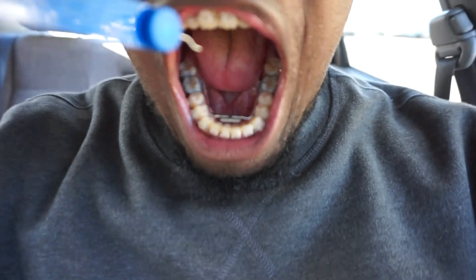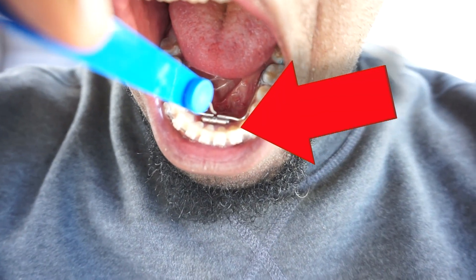So basically what I have to do every single day leading up to my next appointment, which is in two to three weeks, I'm basically gonna have to take this tool, put it in this little hole, push it down, push it back, and that turns it — that's gonna expand my teeth. This is taking a long time, but it should be worth it in the end.